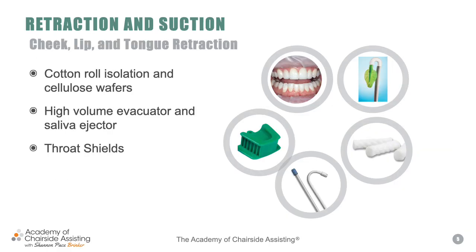Now, when we get into the retraction and the suction, there are so many devices. And today I'm going to try to give you as many as we possibly can. But again, there are so many different products released every year, we can't keep up. So what we're going to go through is just what you're going to see in every ordinary practice.